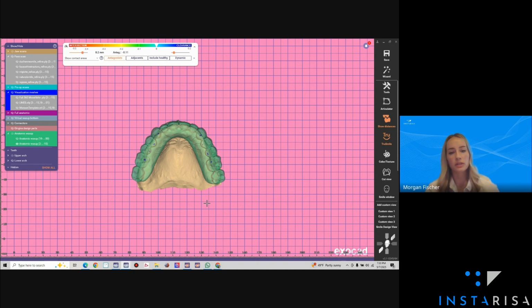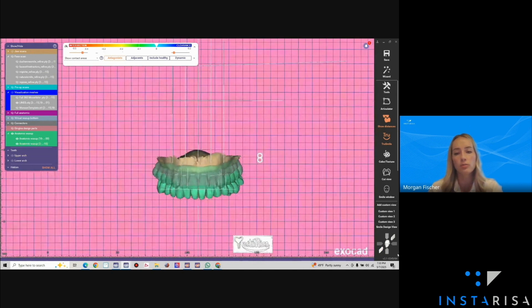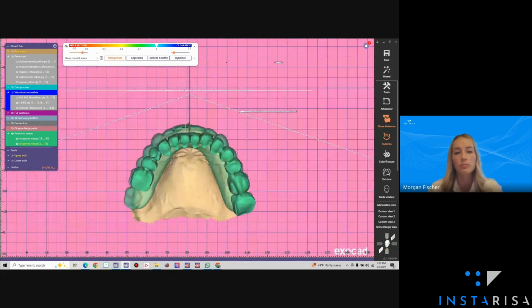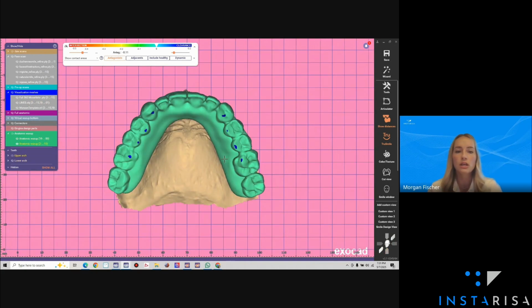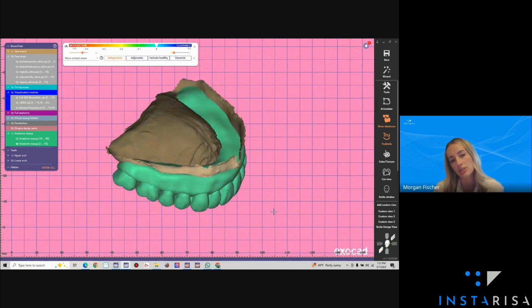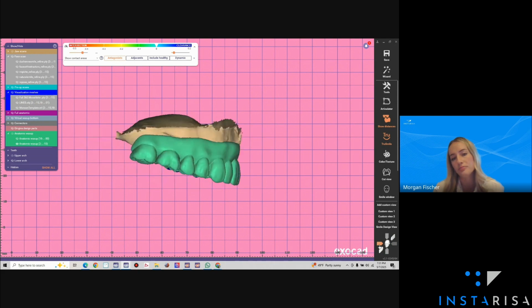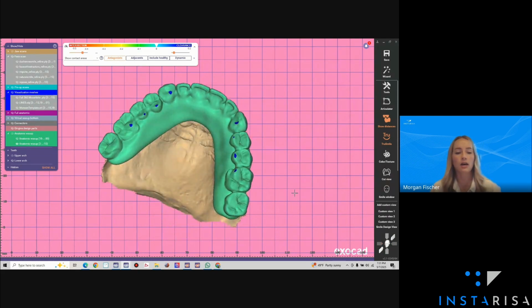It was starting on this patient to get a little bit wider due to doing crown and bridge on the lower. I don't believe that we'll need to go into a posterior crossbite, but I did communicate that with the doctor on the script here. So if we need to go into a posterior crossbite, we can, no big deal. And I did keep second molars on this prosthetic just because Dr. Dodrell does pretty frequently place pterygoid implants, and we're not occluding with anything on the lower anyways.